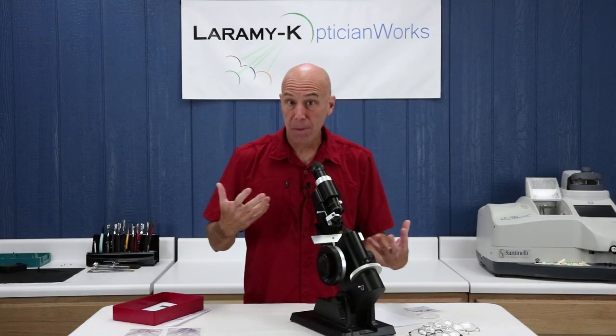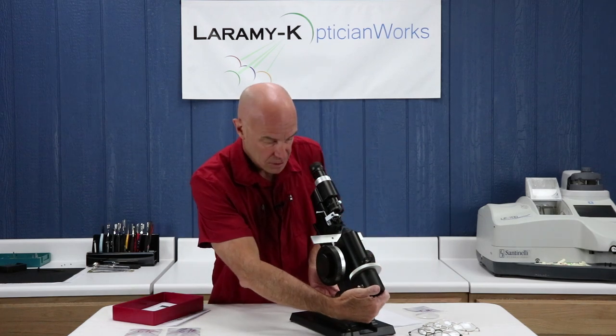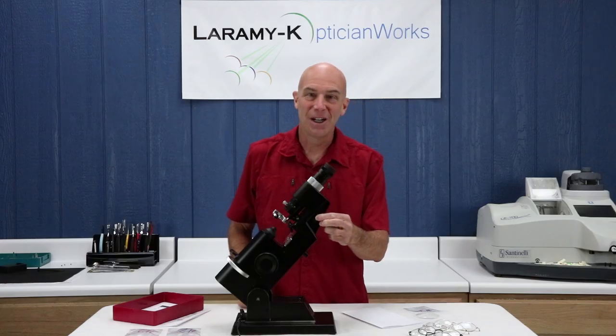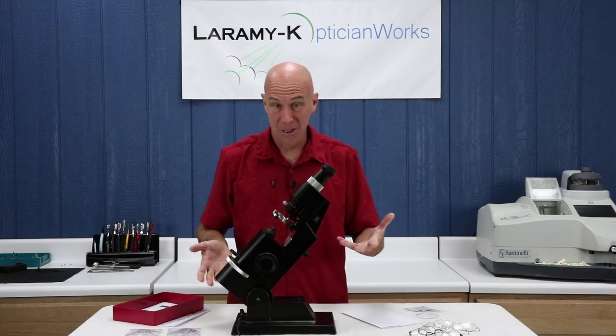Okay, we've decided on which power source we're going to use — we're either going to plug it in or run it off of batteries. Regardless, the next thing we need to do is turn on the lens meter. The on/off switch is located on the side here. Just use it to turn the lens meter on and off.